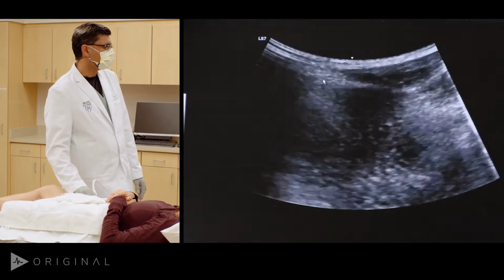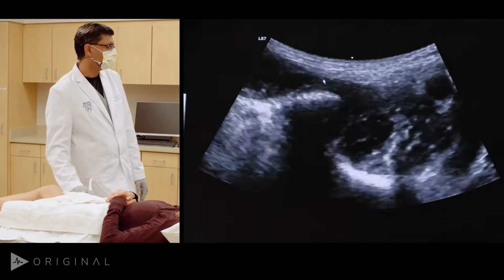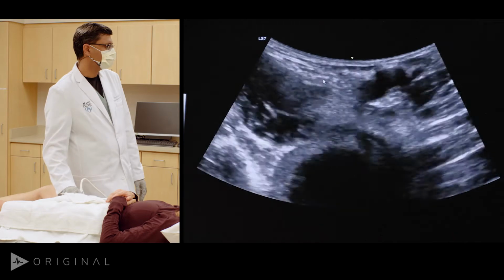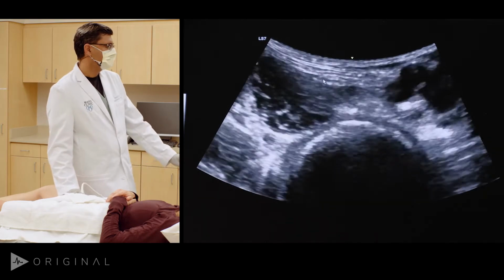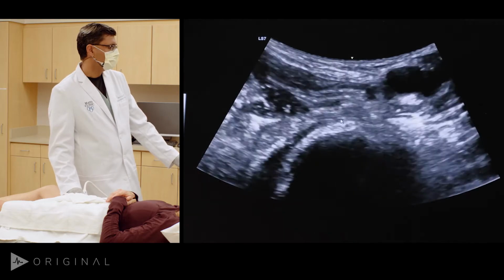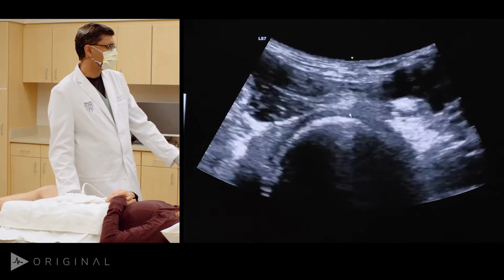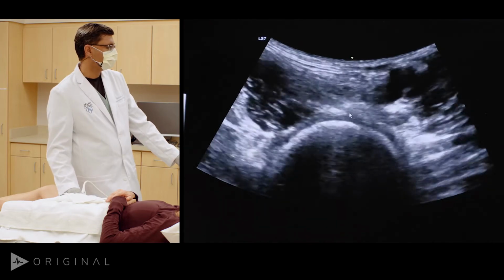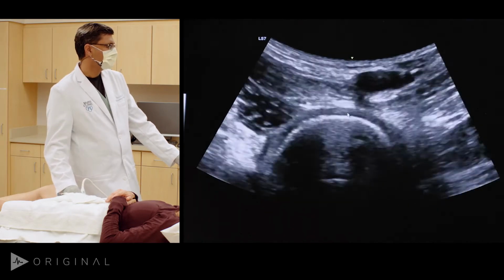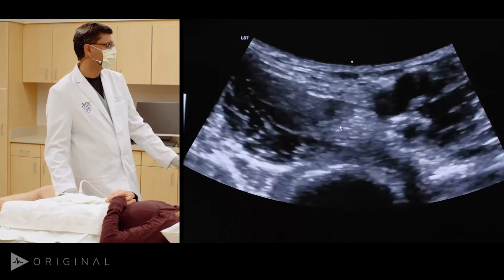Now, before we wrap up this anterior evaluation of the hip, I want to go back to the iliopsoas tendon to demonstrate one thing. Very often we get the request to look for iliopsoas tendon impingement, or rather what they call the snapping of the iliopsoas tendon. What is the intention when we are evaluating the iliopsoas tendon?